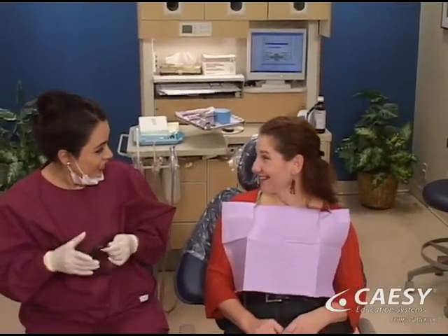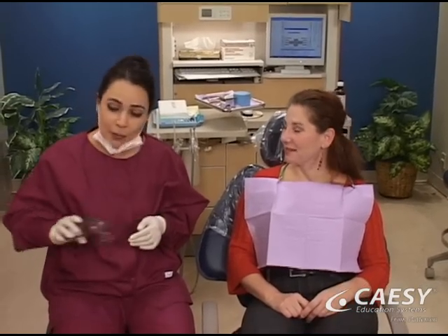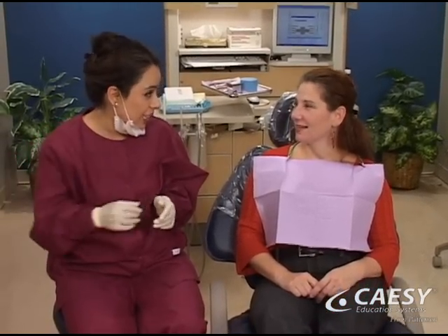Scaling your teeth with an ultrasonic scaler is an effective and efficient method for helping you keep your healthy and beautiful smile.